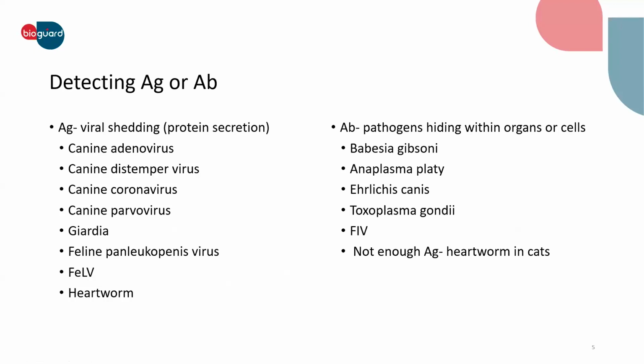Speaking of diagnosis, most of us will think about the rapid test. That's the most commonly applied diagnostic tool for infectious disease in clinic.